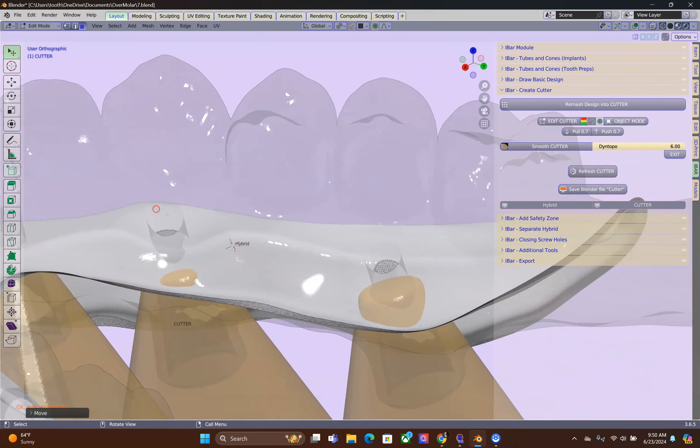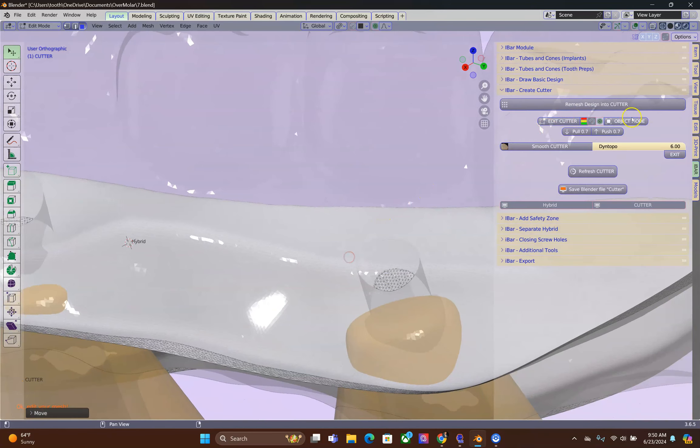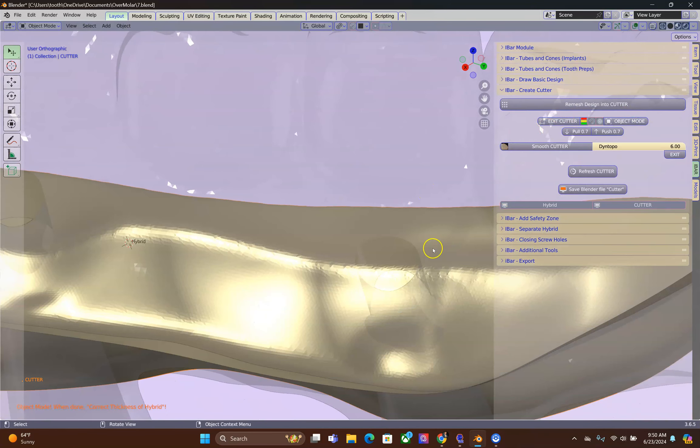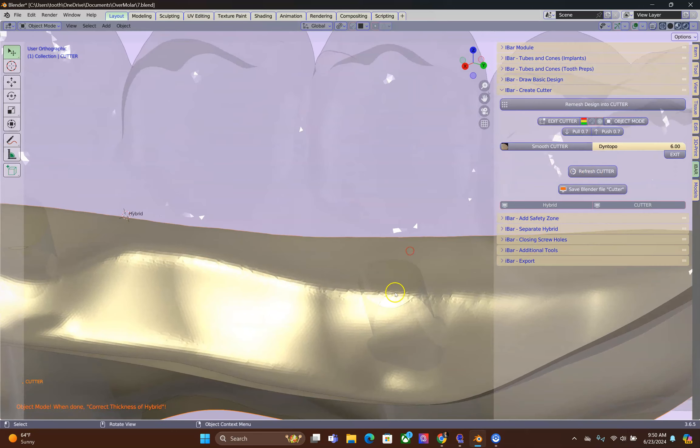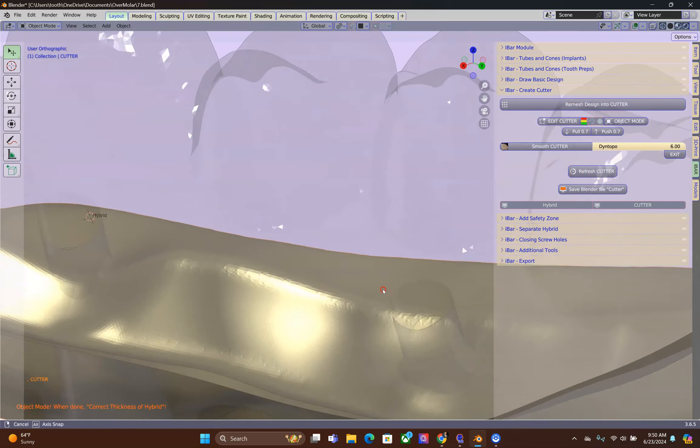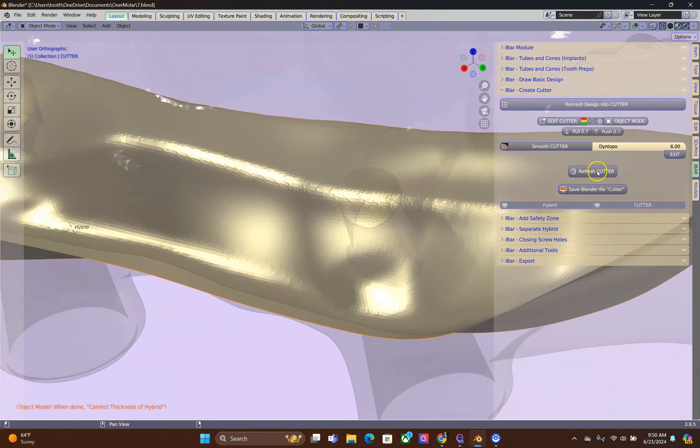We're going to then remesh and refresh this cutter. So in object mode, click on Refresh Cutter. Now, the vertices that you've moved inside of your cone are going to then pop back out. And this is a step that cannot be missed.